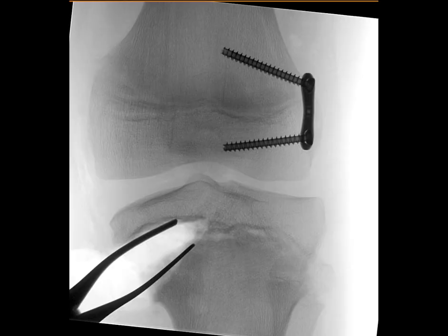Once the osteotomy has been completed, we start lifting the hemiplateau up with the osteotomes themselves or with a lamina spreader. This particular part of the procedure requires some patience, so take your time, free the front cortex and the back cortex, and use the viscoelasticity of the bone to its fullest to elevate the hemiplateau. And this is important to prevent a breakthrough of the joint surface. I'm happy with this correction.